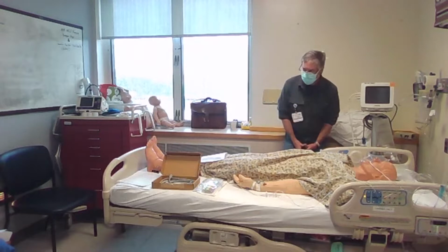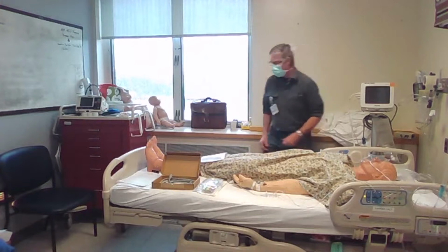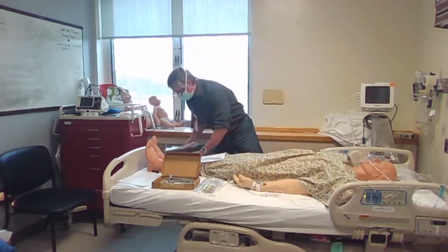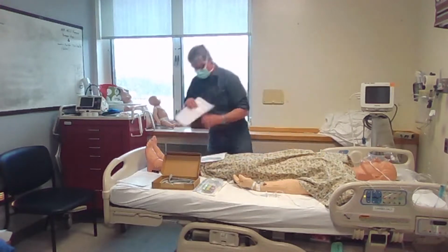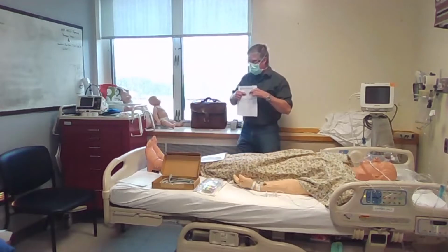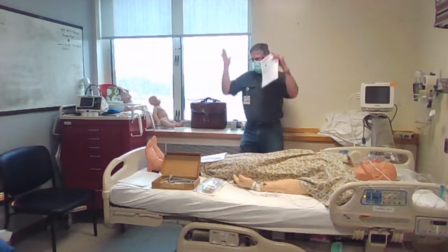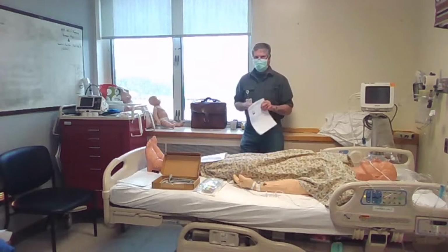Does it give you a systolic and diastolic pressure? Yes, it will give you a systolic, diastolic, and a MAP. And there's a waveform, which is great, that I can show you. This is a typical A-line waveform, that part right there. And they call that the dicrotic notch, which is when the aortic valve closes.